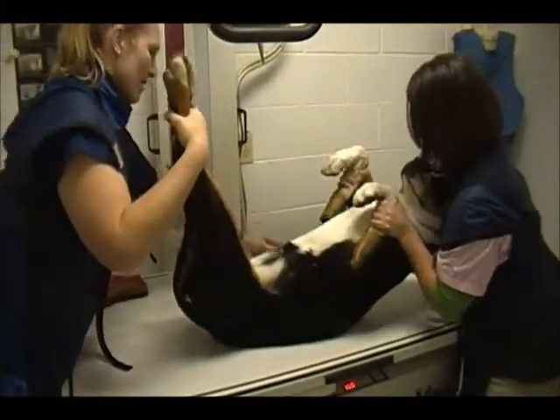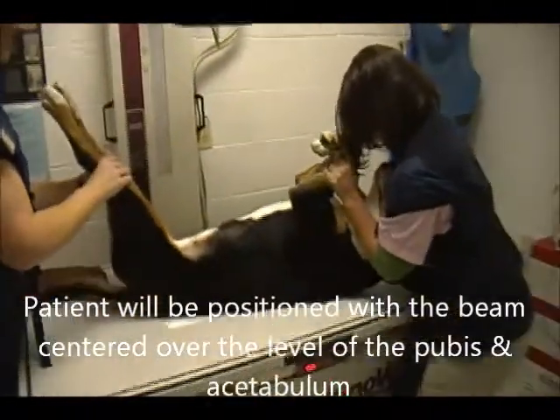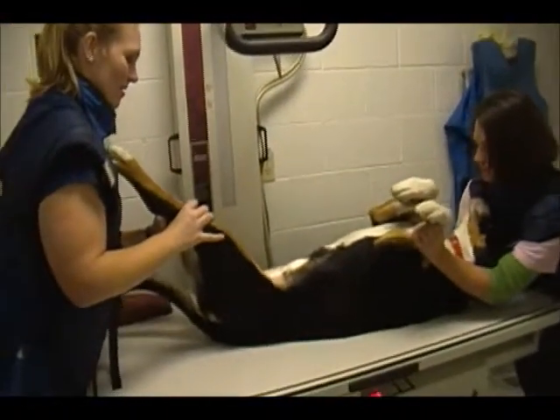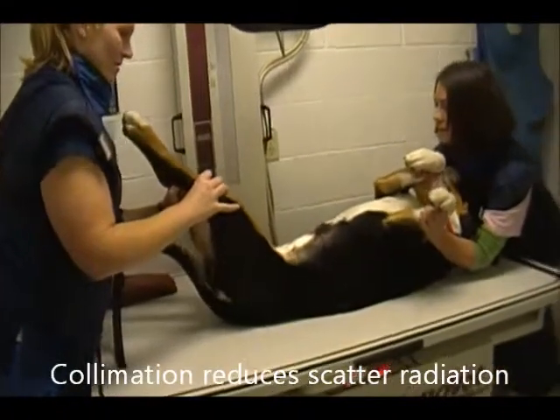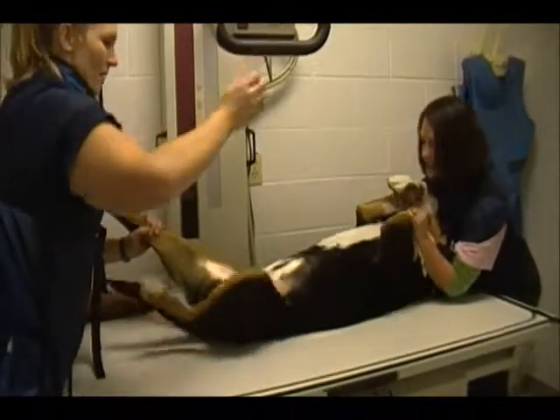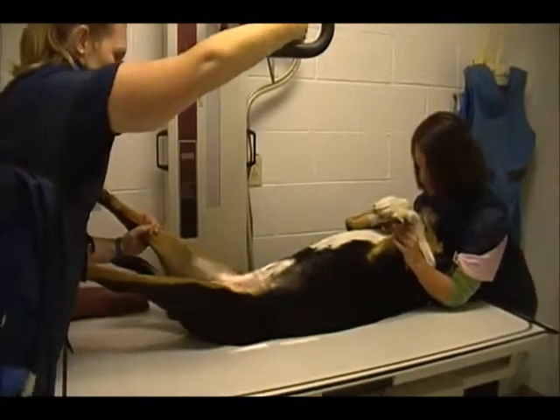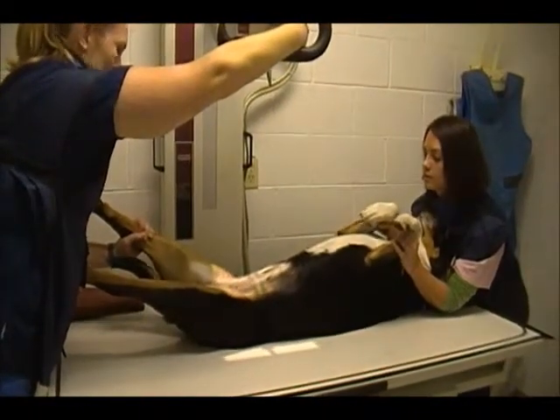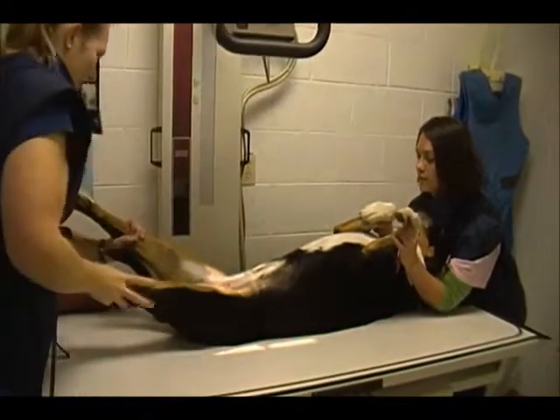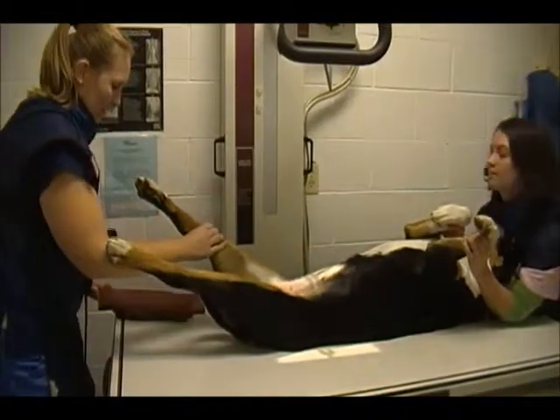We put our marker down. We're going to make sure we get the pelvis in extension and we're going to collimate down to that area to reduce the scatter radiation. Make sure we have our lead gloves on.